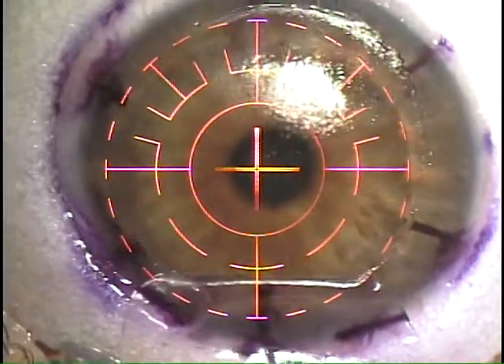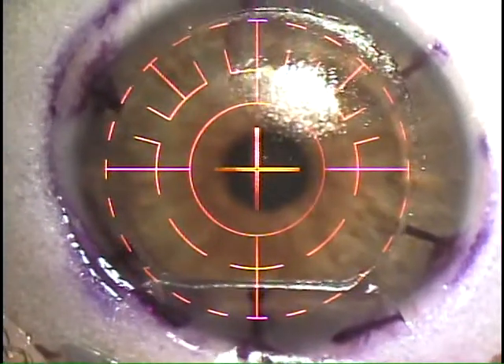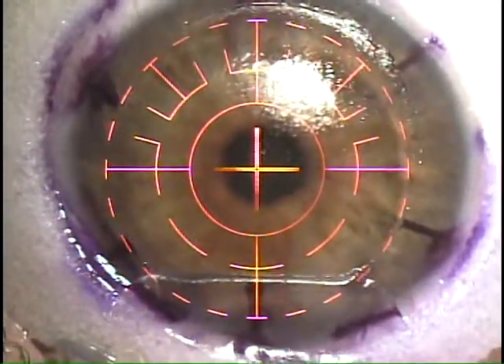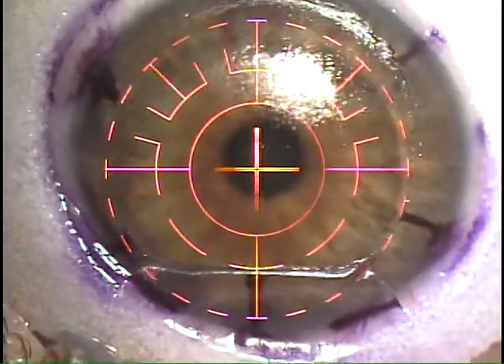Turn off the reticule so you can see a little better. I'm going to turn it off. Tone down a touch.